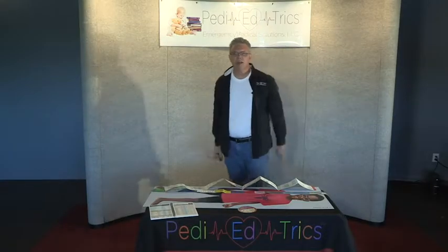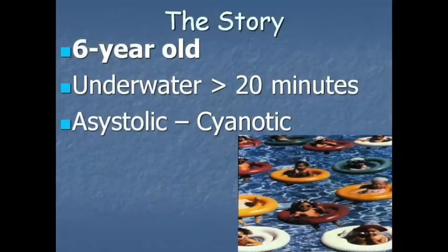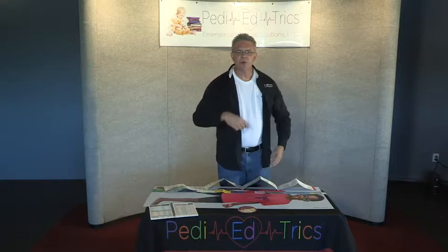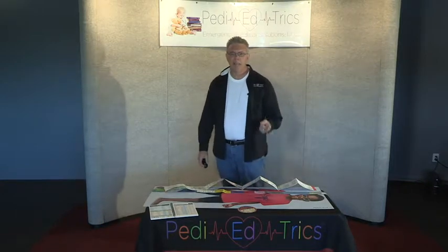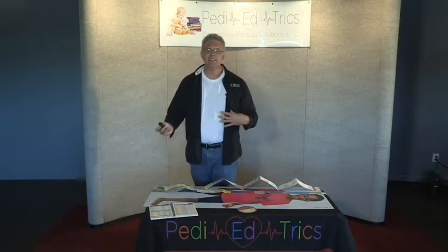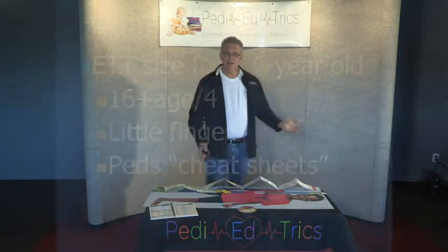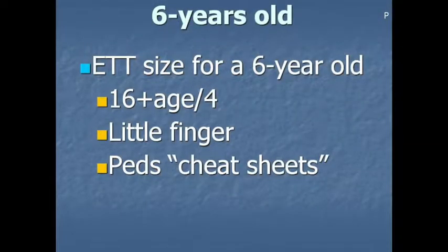So now, for story number 2, let's go ahead and take it up a notch with a pediatric near drowning. So the story, you have a 6-year-old who was under the water for at least 20 minutes. To no surprise, the child is asystolic and cyanotic. EMS is en route to your ER at 300 miles an hour. So with that, if you only have an ETA of just a couple of minutes to get ready for a 6-year-old in full arrest, what size tube for a 6-year-old?